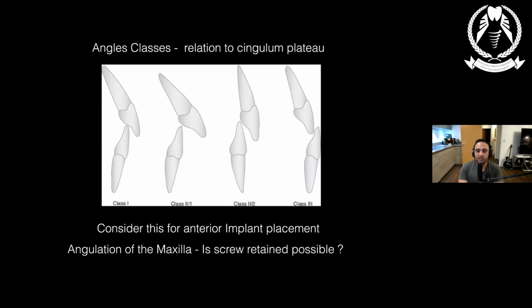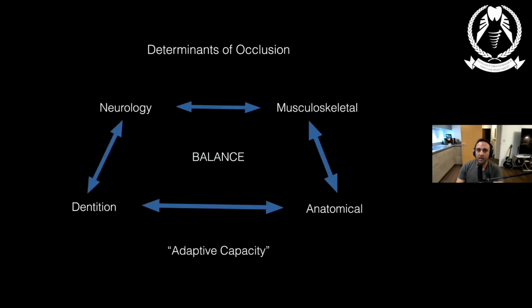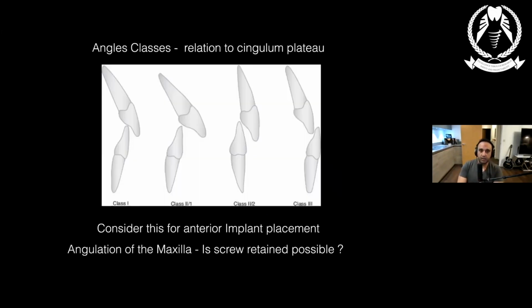So it's important to be able to assess your patients radiographically. I have my own CBCT scanner that I like to look at my patients radiographically and look at the relationship between the upper and lower teeth and look at the skeletal bases. So it's really something that we ought to think about a little bit more, okay, with regard to that.